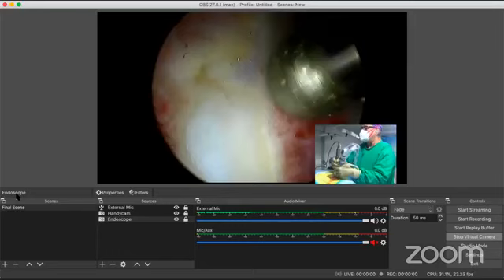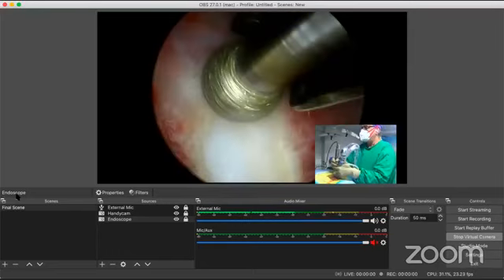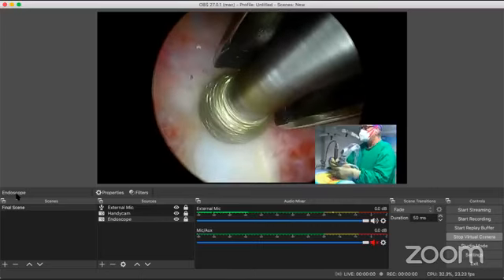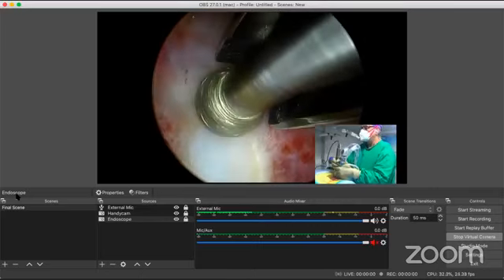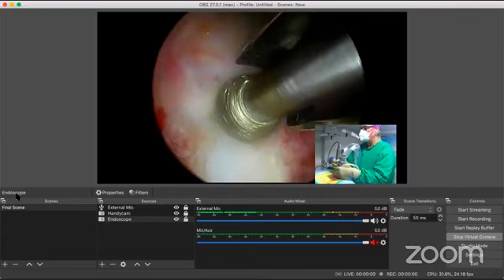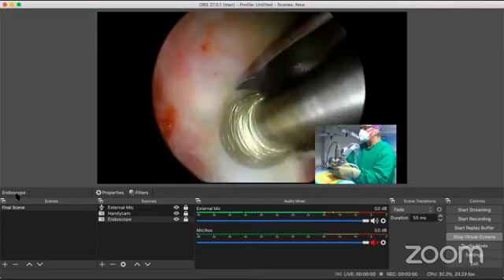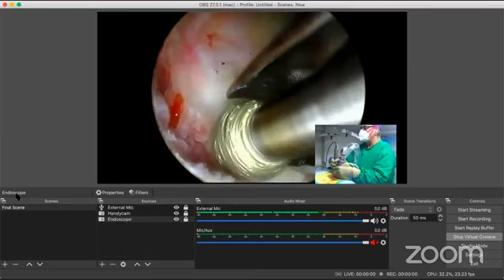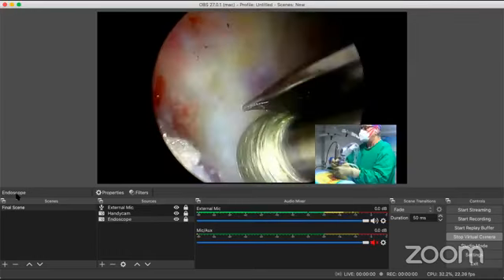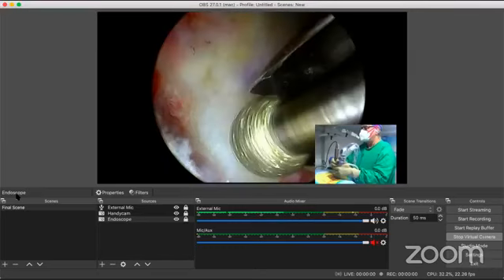This was the original V. You can actually start seeing the dura also slowly. Everything becomes very evident as we burr away slowly.